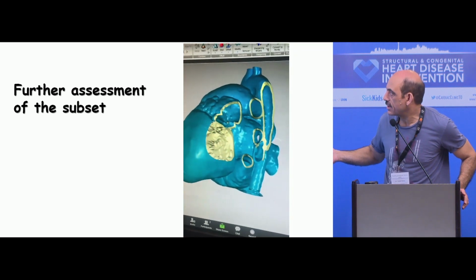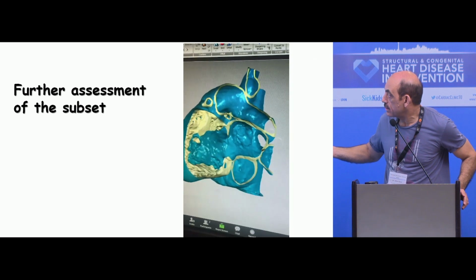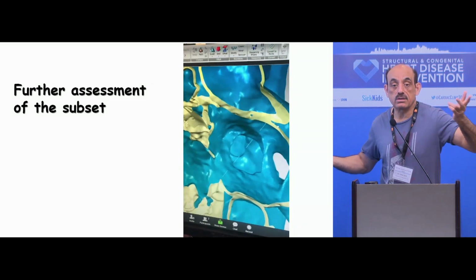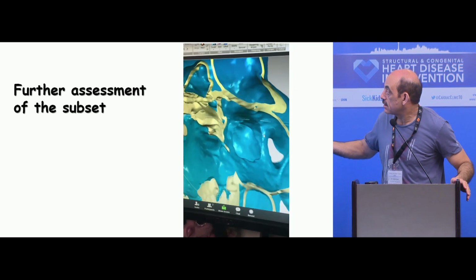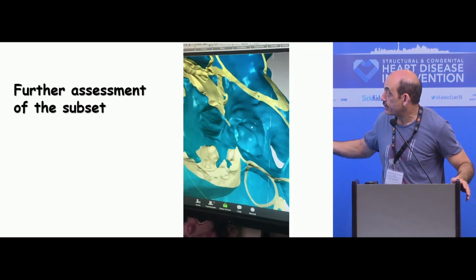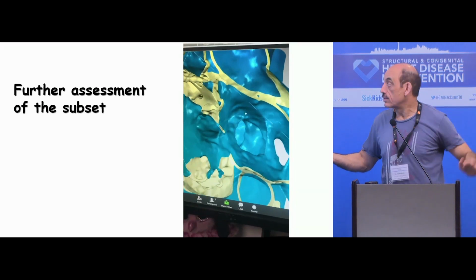Okay, let it run, it's okay. Start appreciating. 1, 2, see this? This is truly the spiral septum. So you don't know where the device should be. It gets cattywampus like this, it doesn't close. And here, see that? Here there is absolutely no rim. There is some rim there, some rim there, but they are not aligned at all. It's almost in 3 dimensions, 2 different planes.